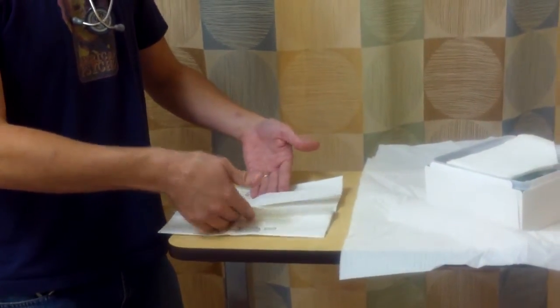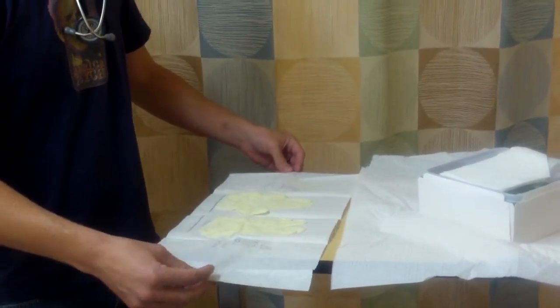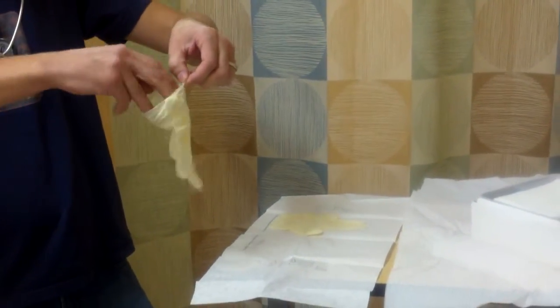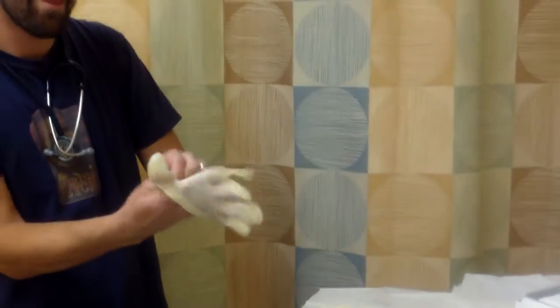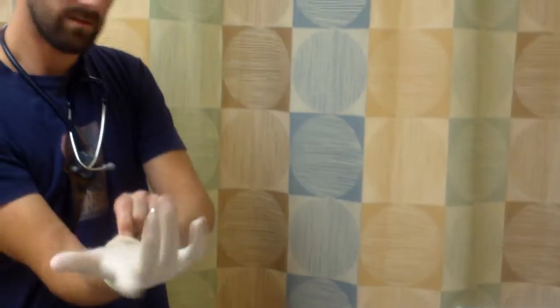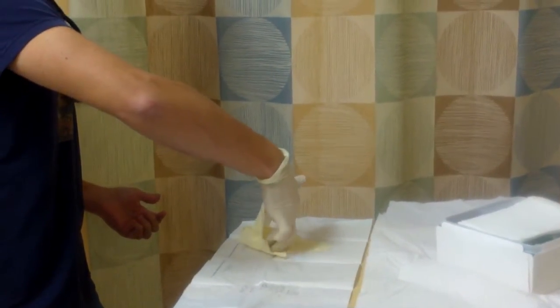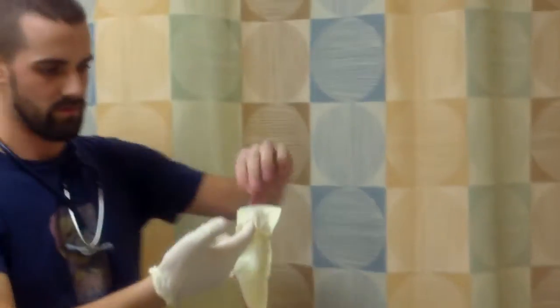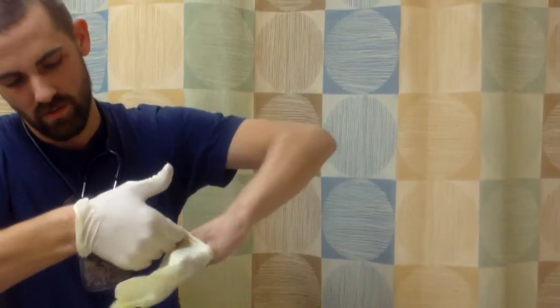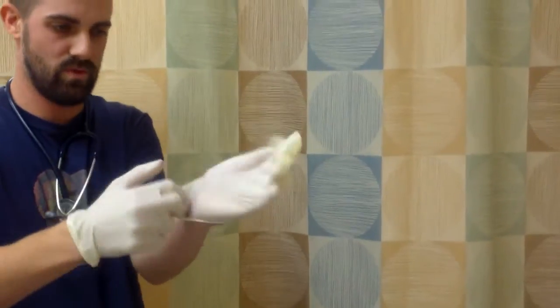So I'm just going to go underneath here. Okay, tent. Alright, opposite hand. Here we go. These things are a little smashed. Alright, here we go. Get that on there, and then I'm going to do the 2 fingers. Go underneath the cuff. That cuff. And then, alright, let's switch the hand around. Here we go. And pull this on.